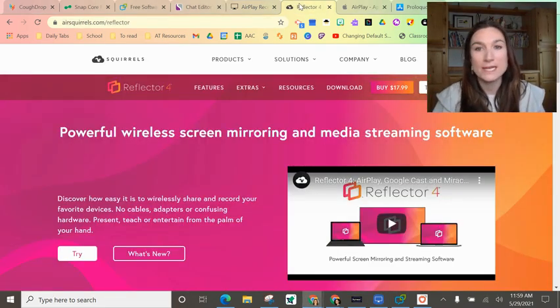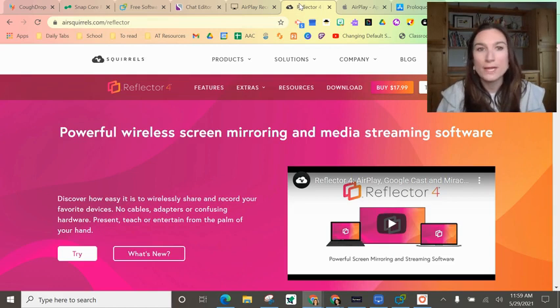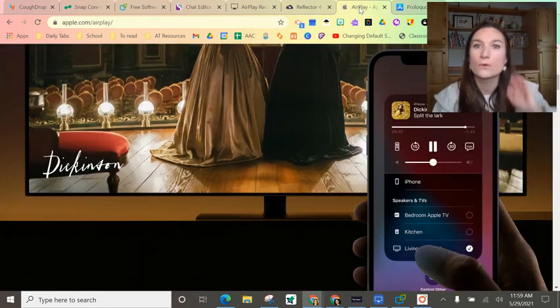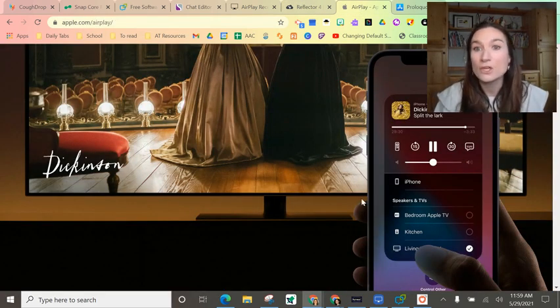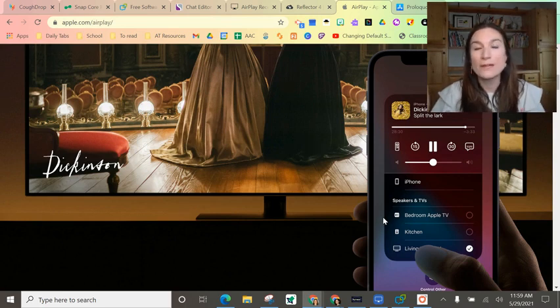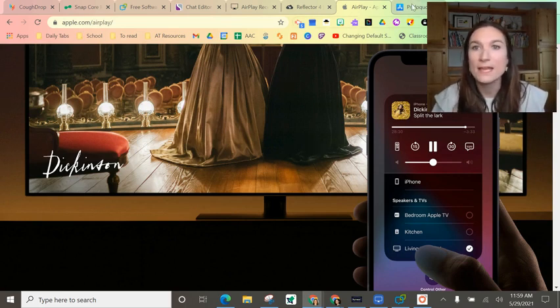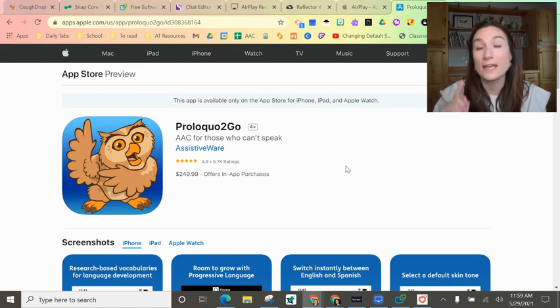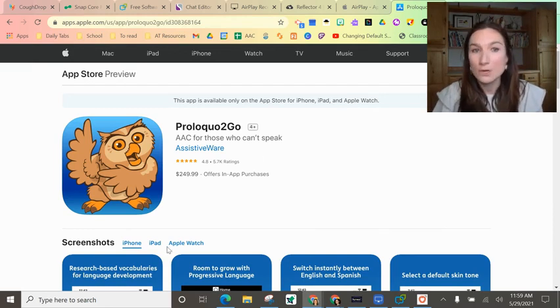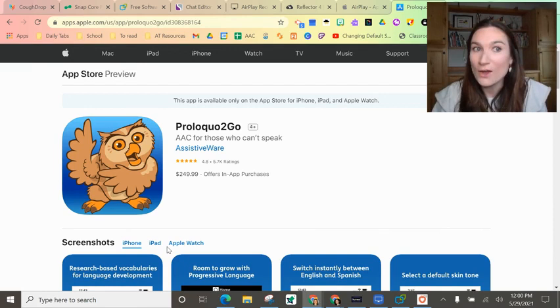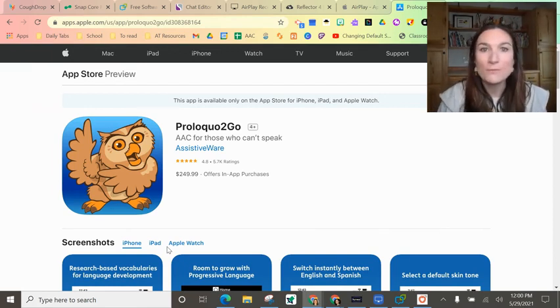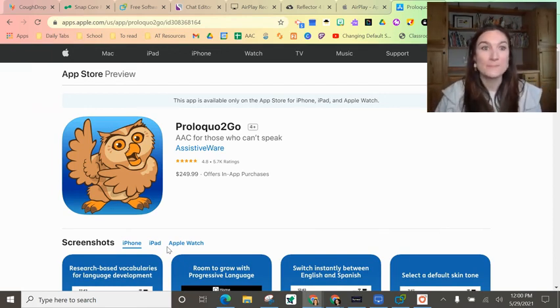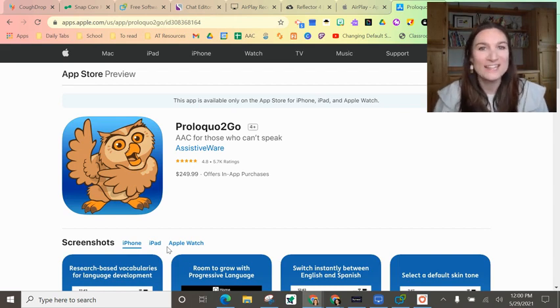Reflector 3 is a paid program. I haven't tried it but I know people who like it. If you have a Mac, you can use AirPlay right from your iPad or your phone to your Mac. Here's another option: if you have a Mac you can go to the app store on your computer and purchase an app and download it. I hope this is helpful and gives you some ideas for getting a system up on your computer to provide aided language input.